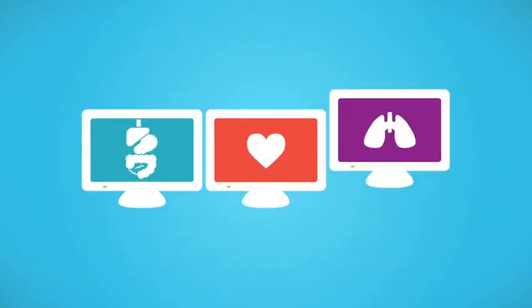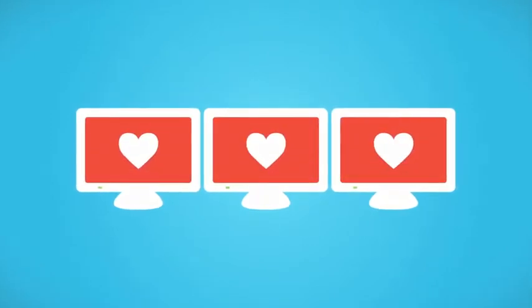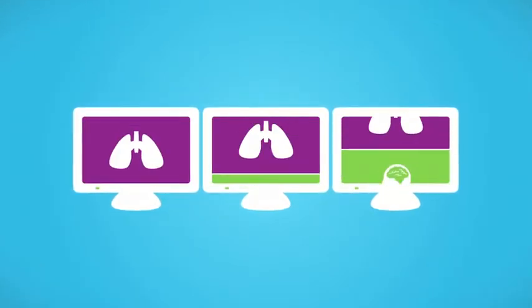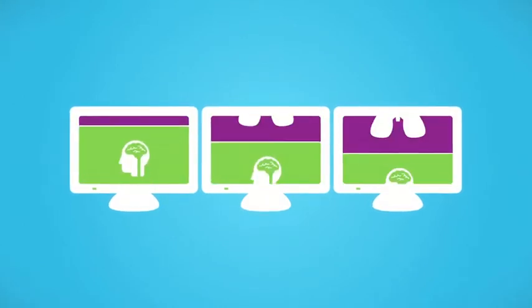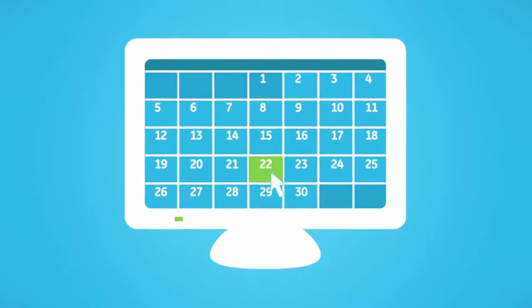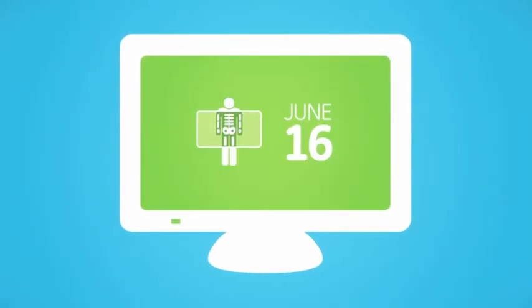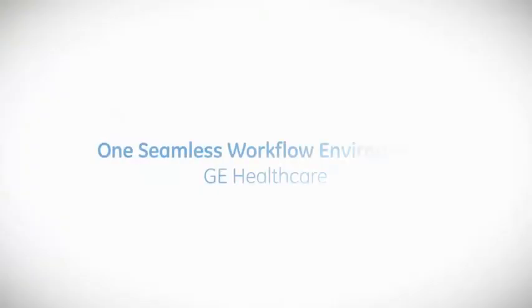Each unique patient is synchronized to his or her images. So what you see on the PACS is exactly the same on the advanced visualization, reducing the possibility of overlaps or errors. Need a previous report? One database means previous cases are instantly accessible and ready to use with GE's entire suite of advanced tools.